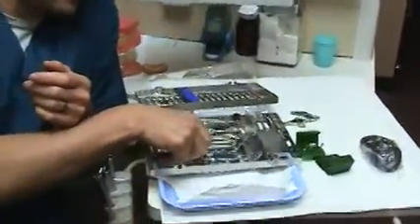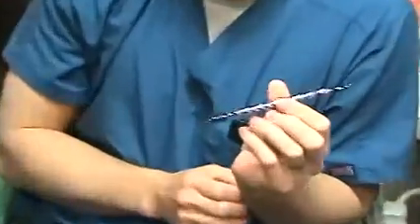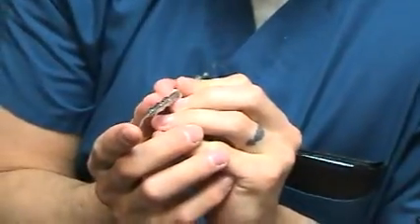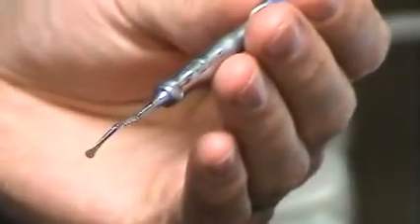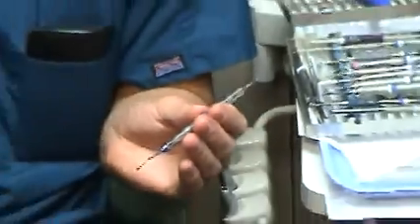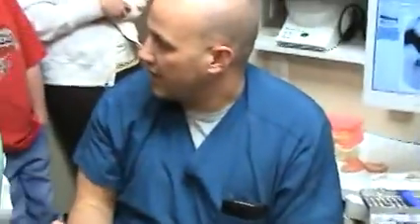This instrument here is a cord packer. Do you guys see the kind of shovel-end shape on the end of that? How many of you guys in here have ever got something stuck in your teeth after eating popcorn? It feels like you can't get it out, and it's just like, where is that? I can't get it out of there.